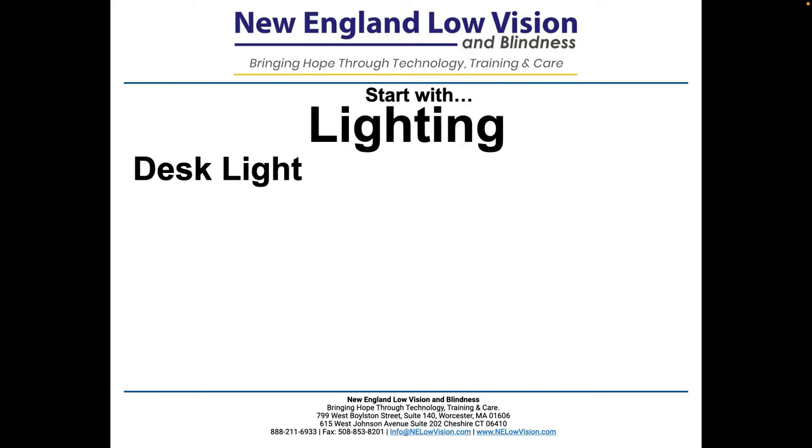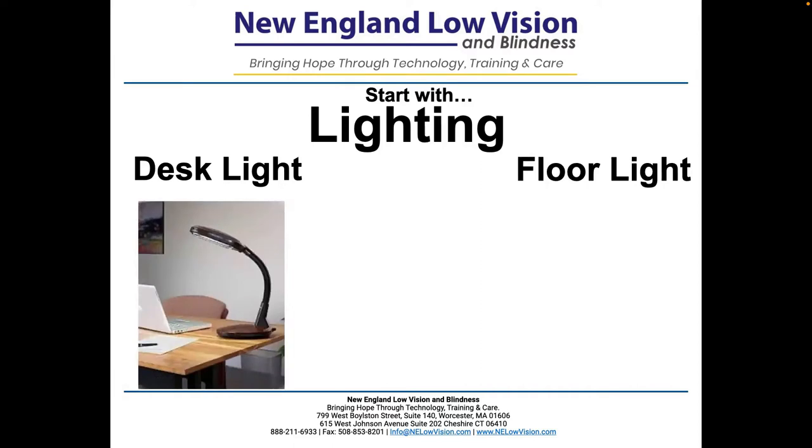And one light, and forgive me for saying these types of words. If you're playing basketball, you need a basketball. If you're going to go running, you need running shoes. So I'm going to talk like that. I don't want to sound offensive, but I'm going to talk that way just for the sake of our time, to help break through any preoccupation, so that you can go back and look at it and just know that this is coming from our experience that you need this stuff. The person needs a desk light, as Dr. Toomey mentioned. The person needs a floor light. It's task lighting. It's at a perpendicular angle.